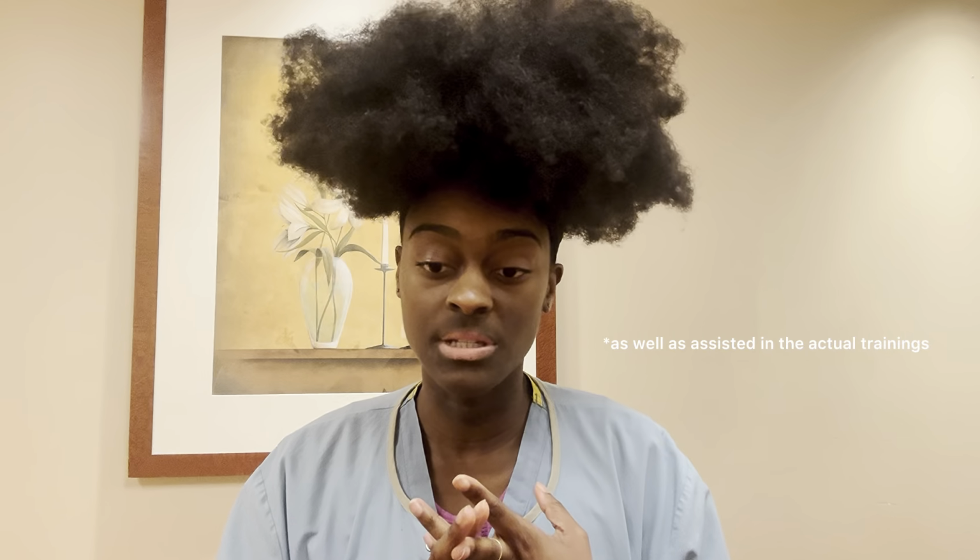As a simulation technician, I help with whatever's needed in the sim lab. I have done setups for different simulations, like setting up for the suture training, I have set up for the vaginal delivery simulation, and I have set up the IV arm.